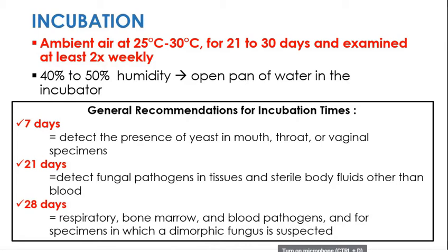So, the answer is already here. You have to keep it for 1 month. Okay? Generally, bago mo i-dispose yan, kailangan mo muna yan i-keep ng 30 days. And then, pag after 30 days, wala pa rin growth, that's the only time you can dispose of it and sabihin nyo, no growth.